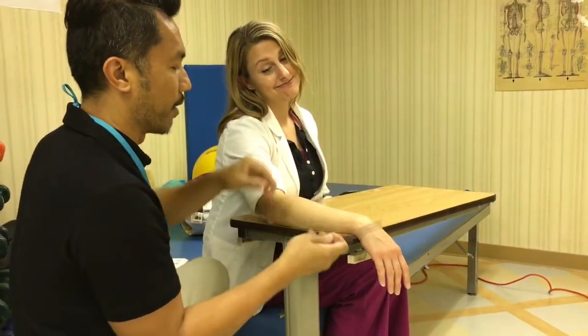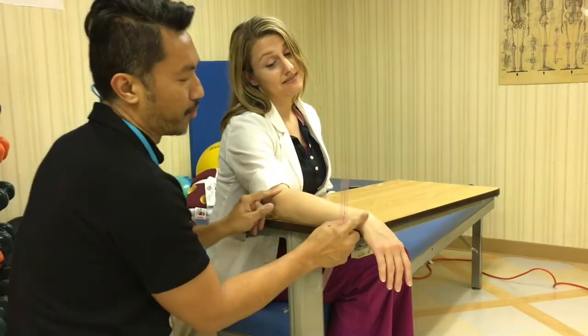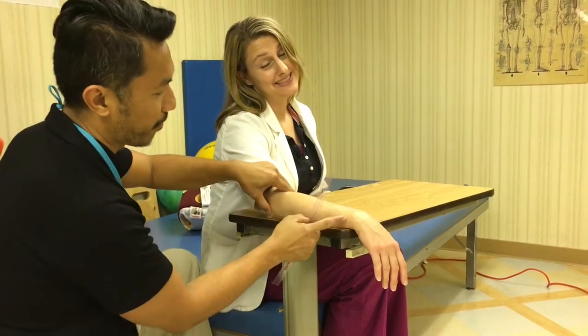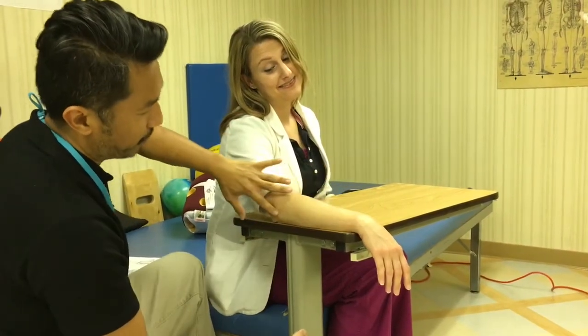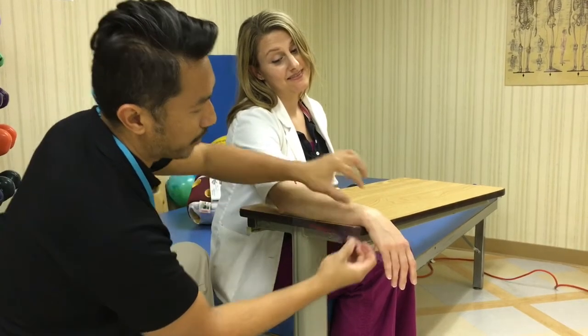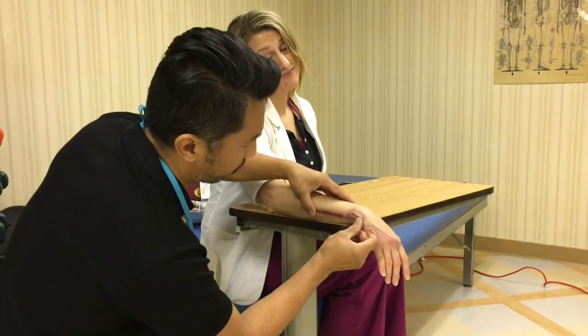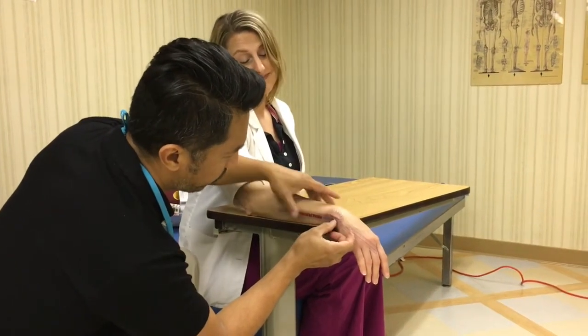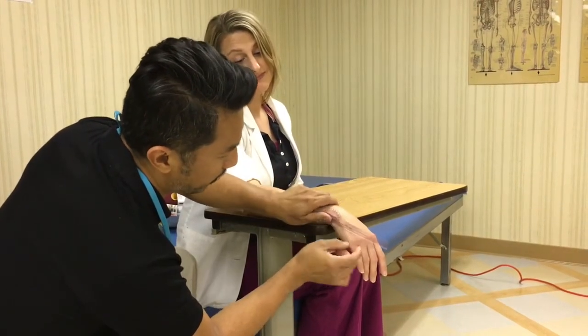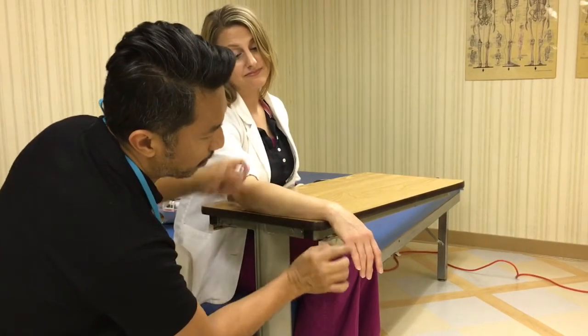now I can start positioning the goniometer, and there are three bony landmarks that we need to figure out. First is the shaft of the ulna, so that's where we're gonna put the proximal arm, the non-moving arm, and then the triquetrum, and that will be our axis, our fulcrum. So right here and here, and then the moving arm would be placed on the fifth metacarpal.